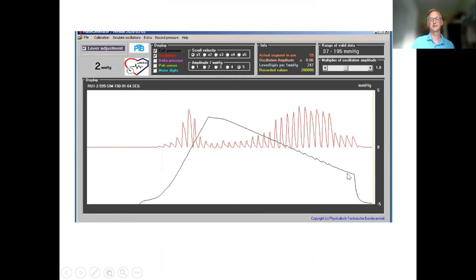And at the same time, here is the opening valve, which deflates the cuff pressure. And here are the oscillations. This red curve here is basically just oscillation. So this is the trend subtracted and amplified, and then you see first you have a couple of fast oscillations on the way up, and on the way down there are these oscillations.